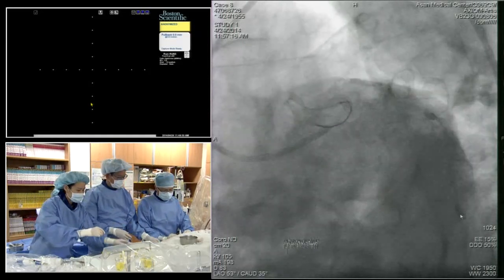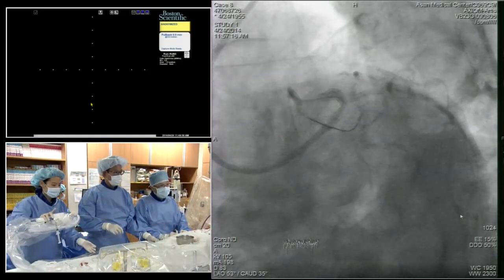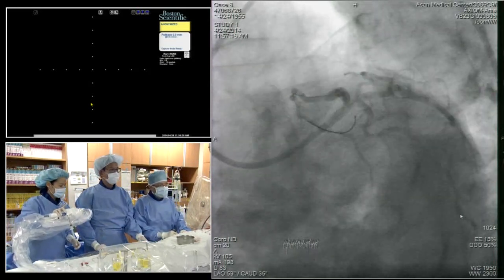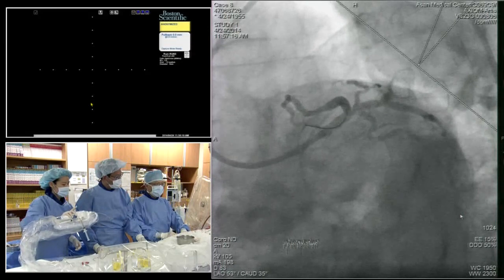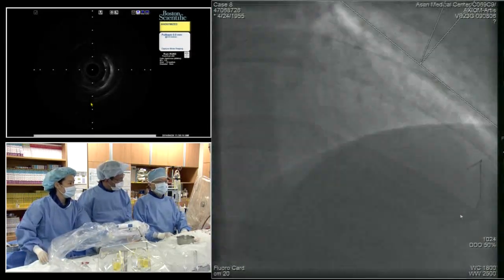It shows after you place the stent that it actually wasn't a quadrifurcation, it's actually just a bifurcation, and then there is a separate bifurcation or trifurcation after the origin of the circ. Yeah, I think so. It's just that when the IVUS is clear, they join and then they join the LAD.